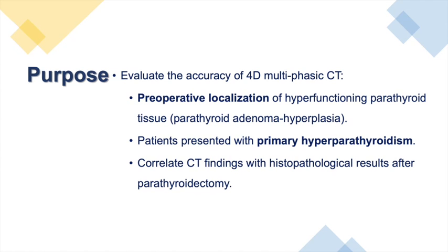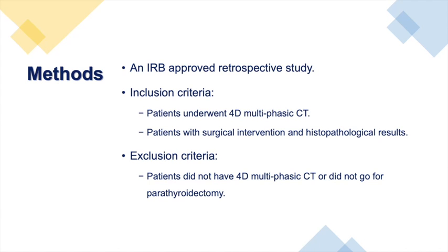We aim to evaluate the accuracy of 4D multiphasic CT in accurate preoperative localization of parathyroid adenoma hyperplasia in patients presented with primary hyperparathyroidism. This is an IRB approved retrospective study. We included patients who underwent 4D CT and surgical intervention with available histopathological results.